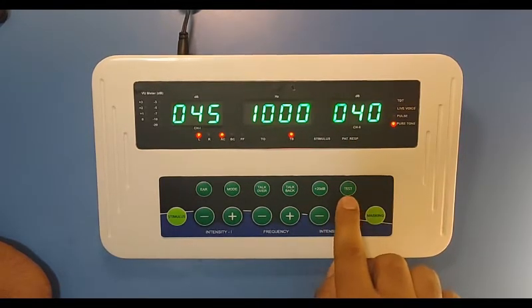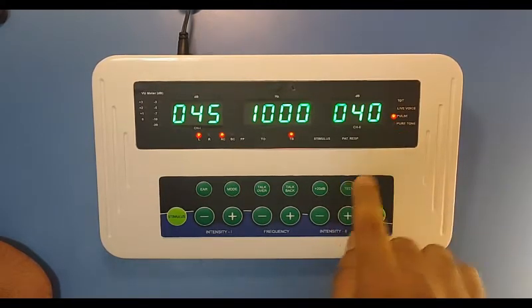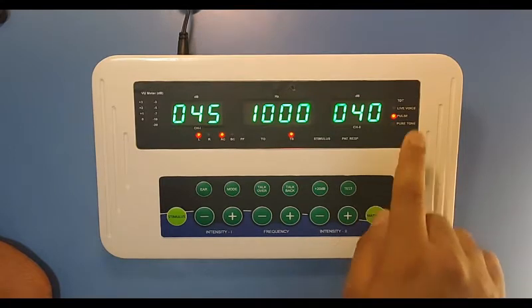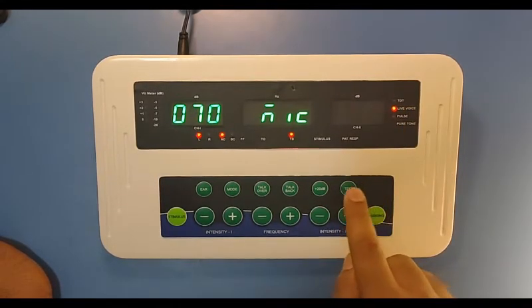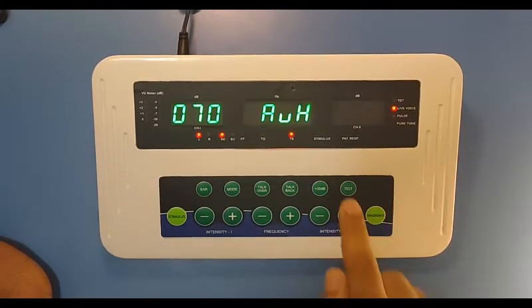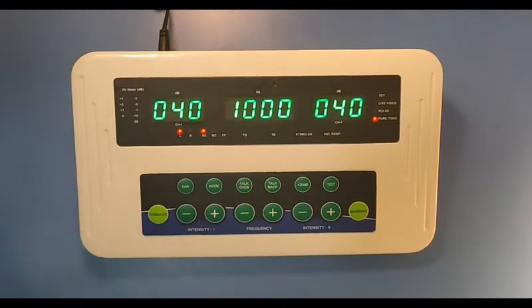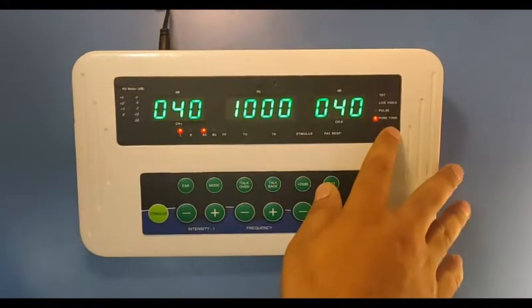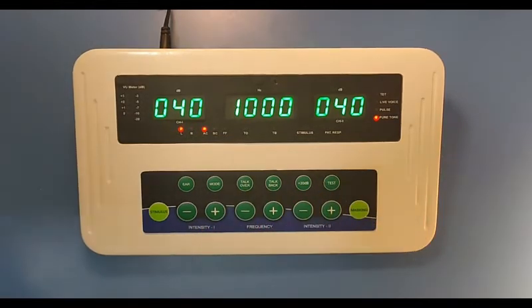This key is to select the test type. For pure tone, you can see the LED is glowing. Press it once and the pulse operation mode will be active. Press it again and it will go into live voice mode. Press once more and it will go to auxiliary in live mode. And then there is tone decay. So in this Audio Mini you will get pure tone audiometry, pulse audiometry, live voice, and tone decay.